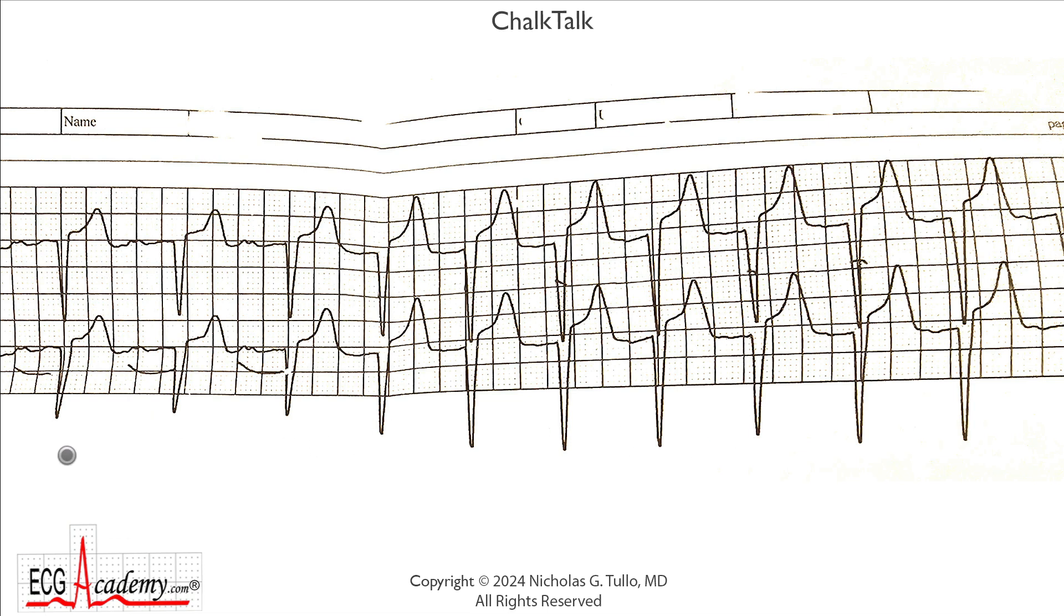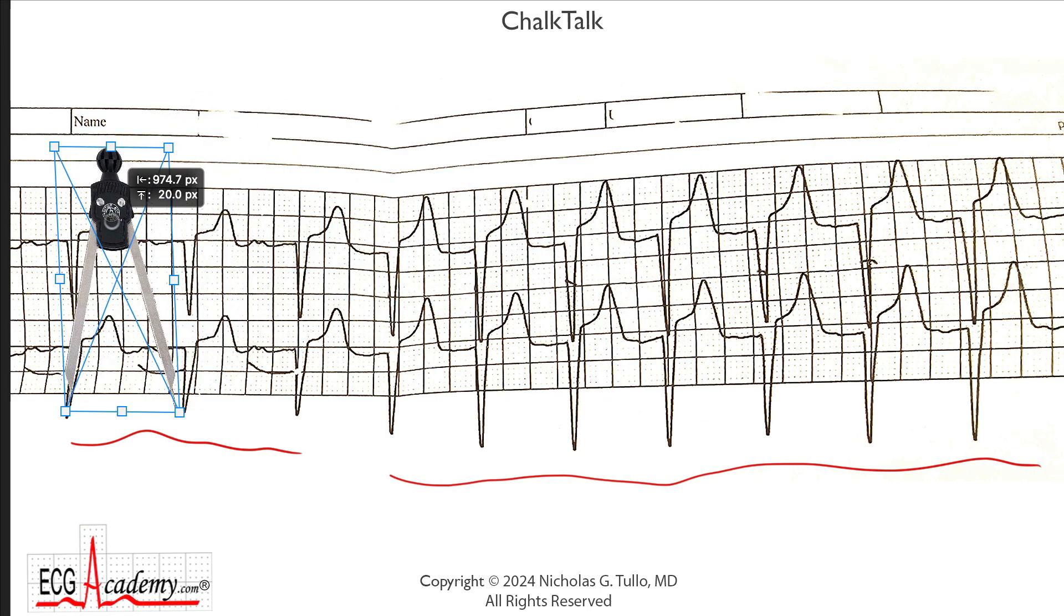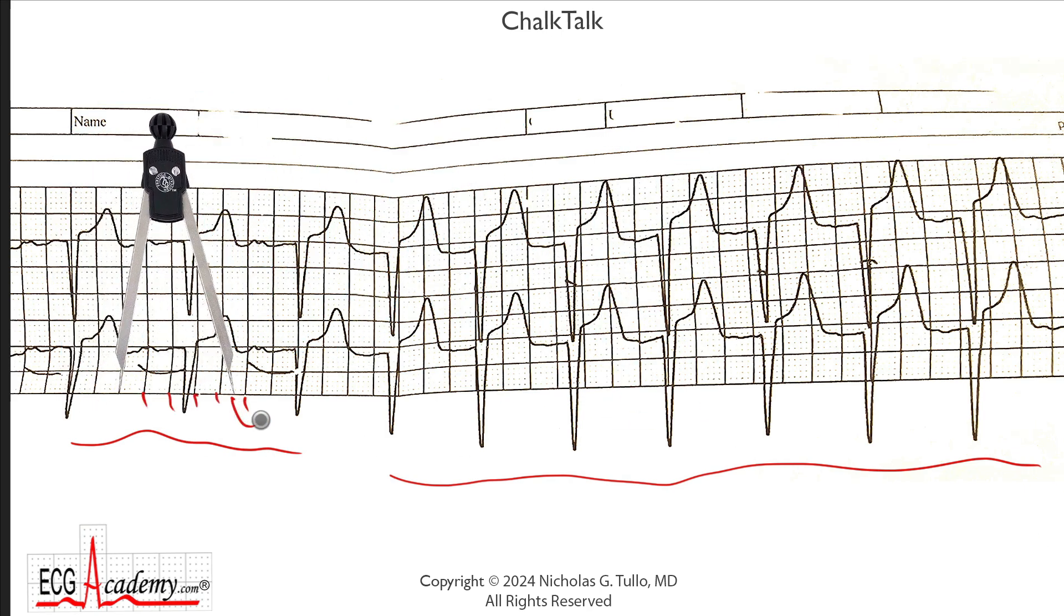When you look at the whole strip, you can see there are three beats on this side, and then the QRS morphology appears to distinctly change for the remaining seven beats. There's also a difference in the rate. If we bring a pair of calipers over to the left side and drag them to the grid, the rate here may be about 68 beats per minute or thereabouts.